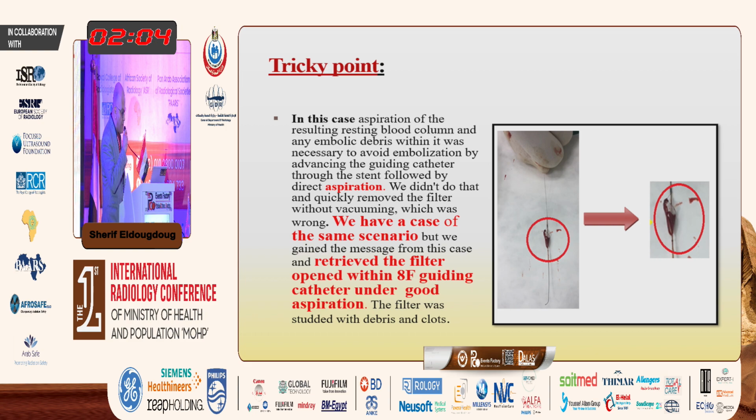We see that the filter shows retained clots, and the control angiogram post intervention is very good, and the patient is clinically with no neurological deficit.